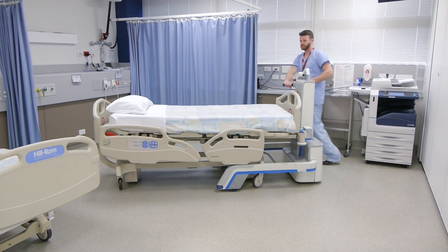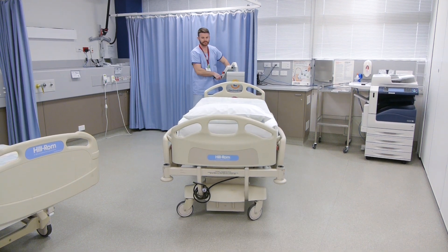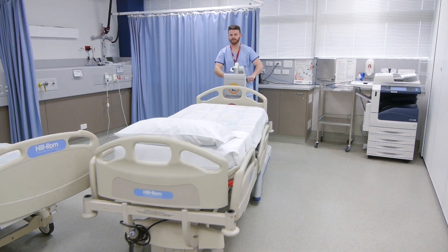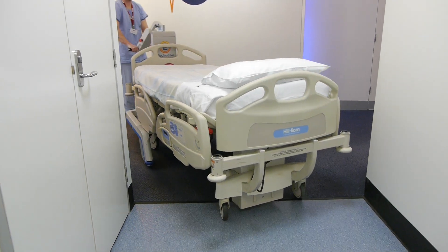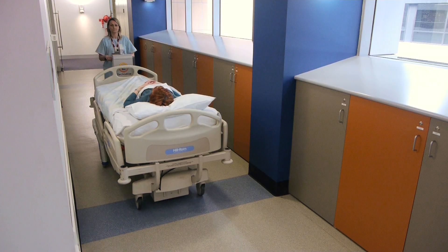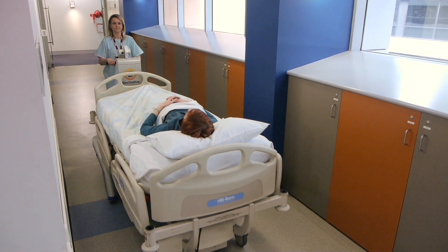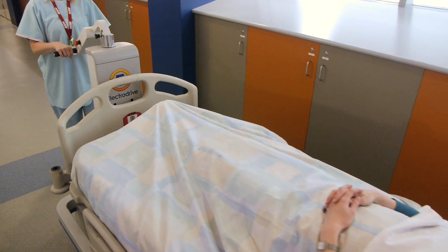The Gezunda is designed to save you effort and reduce the risk of injury when moving heavy hospital beds. It will fit into lifts, travel easily over carpet and up and down ramps, and turn corners with a minimum of fuss. It is simple to use and designed to make life easier for people involved in moving heavy beds.